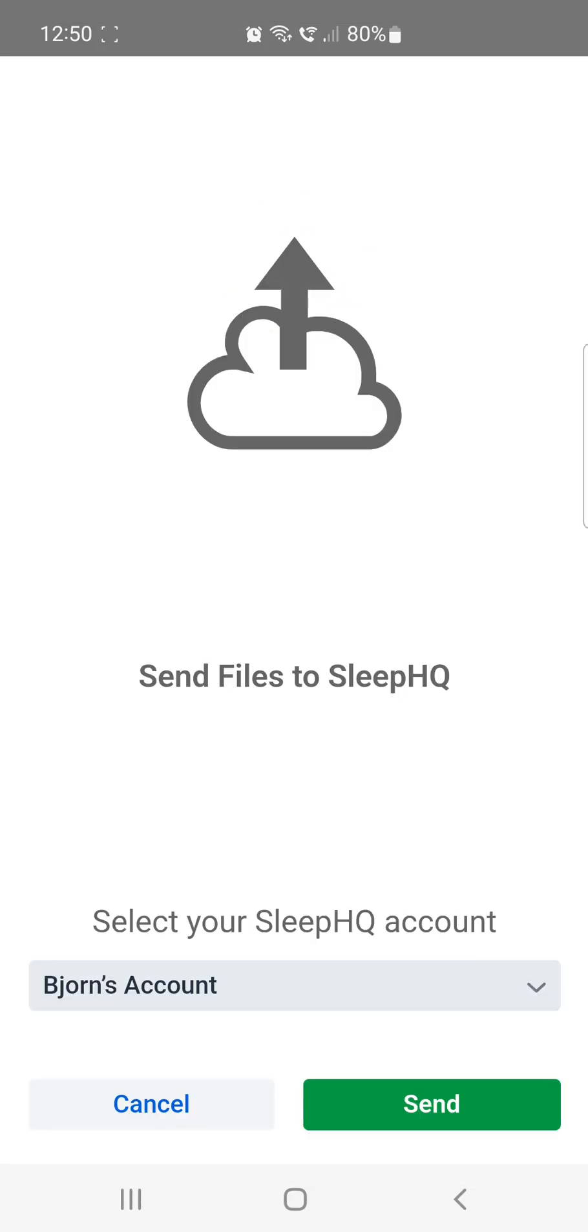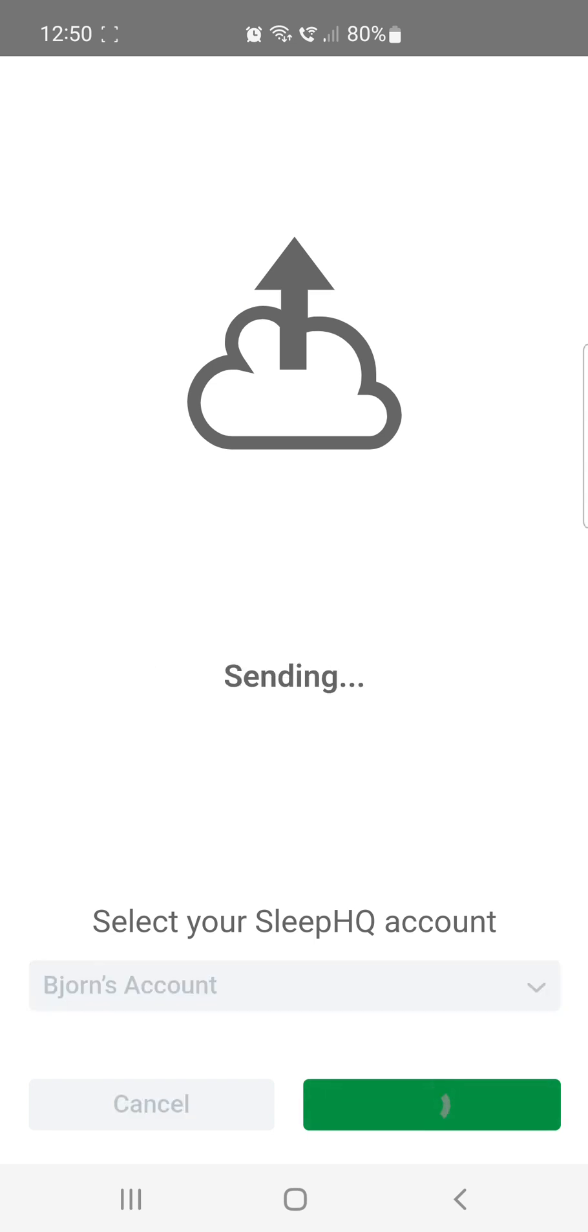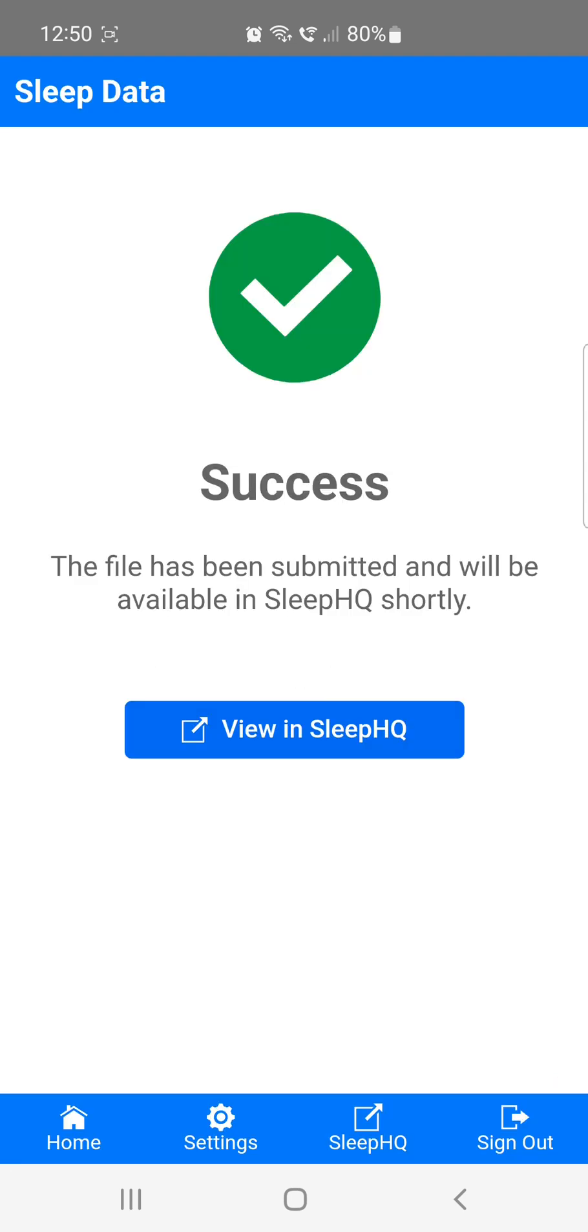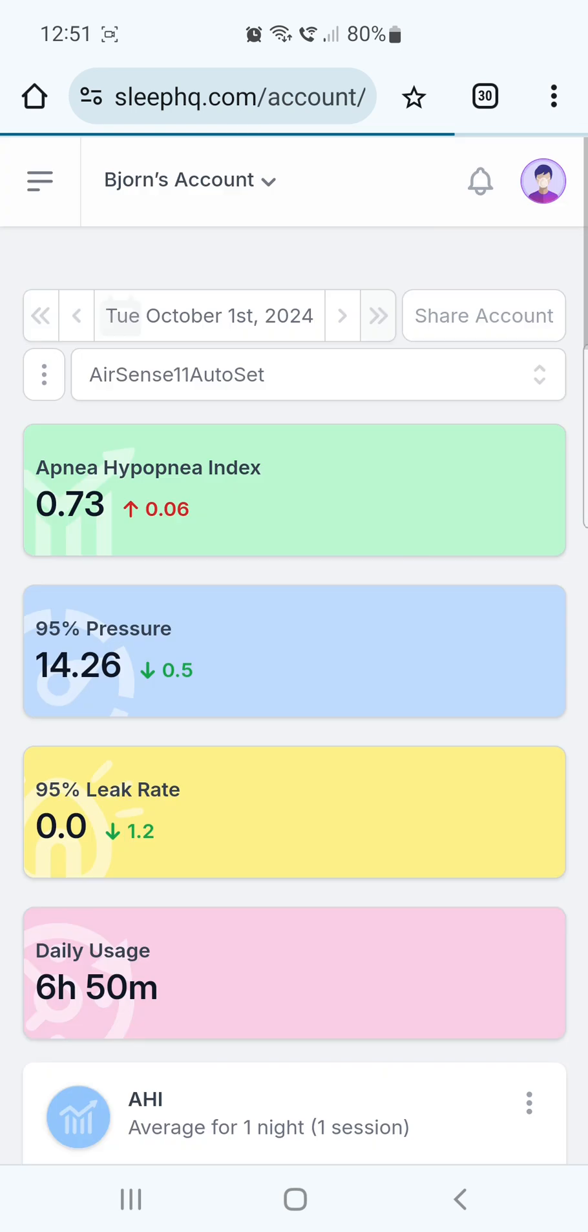This will open up the Sleep Data app again. Now, on the Send File screen, select your Sleep HQ account and press Send. After the data has been sent, you'll see a Success screen. You can now press the blue View in Sleep HQ button to check out your data.